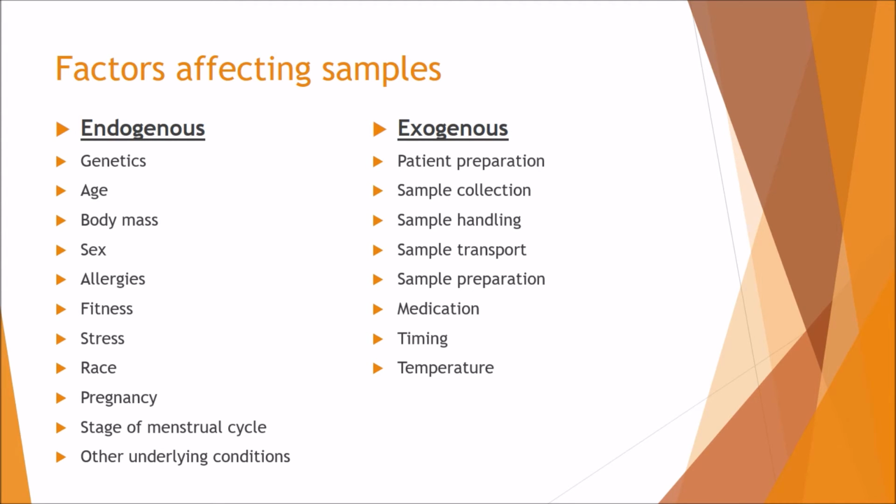For example, putting it in the wrong container, which I'm going to talk about in a minute with vacutainers. These are little tubes which blood gets put in prior to testing. This can affect the coagulation or how the blood behaves for certain tests. Medication is another thing. Whether the patient is on any medication during the time of analysis, so you can change the medication easily and then do further tests on that.